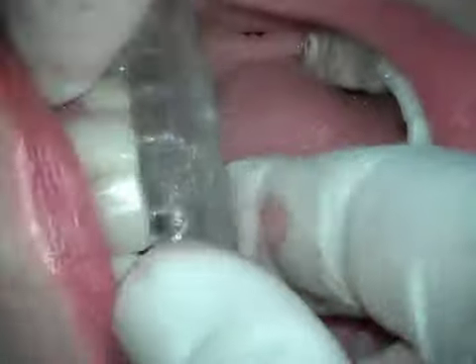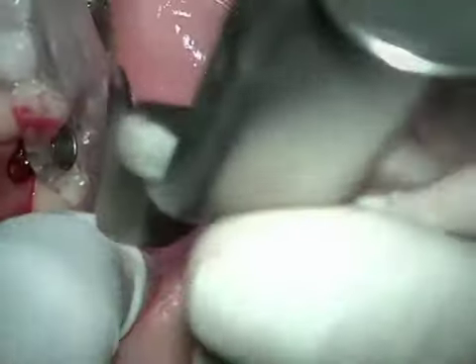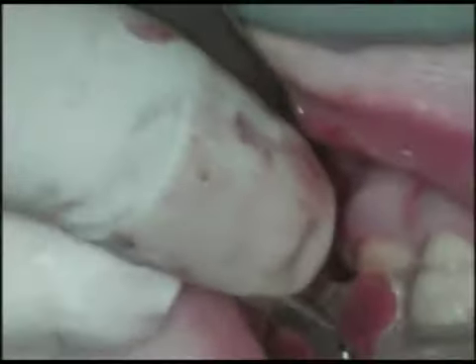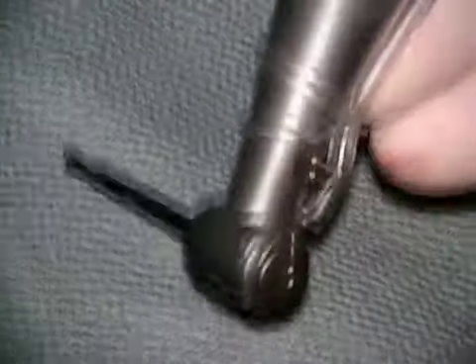Now I'm going to try in the surgical template. This is a GALILEOS surgical template made off of our CT scan data. And this particular implant surgical guide is fitted with a Nobel Guide diameter sleeve for a regular platform implant. So we're actually going to use a Nobel Guide drilling set and place a Nobel Replace Select implant into this site using the surgical guide to help us with very accurate implant placement.